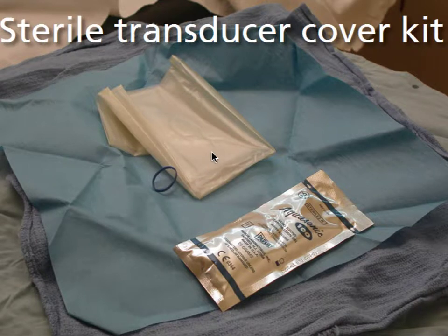You can roll up the transducer sheath, put your hand inside of it, and then grab the transducer out of the holder on the machine, making sure that you don't contact any other non-sterile areas. Remove that from the holder, fully elongate the transducer sheath, put the rubber bands on, make sure that you've got gel still over the footprint of the transducer, and now you can apply the sterile ultrasound gel to the outside of the sheath.